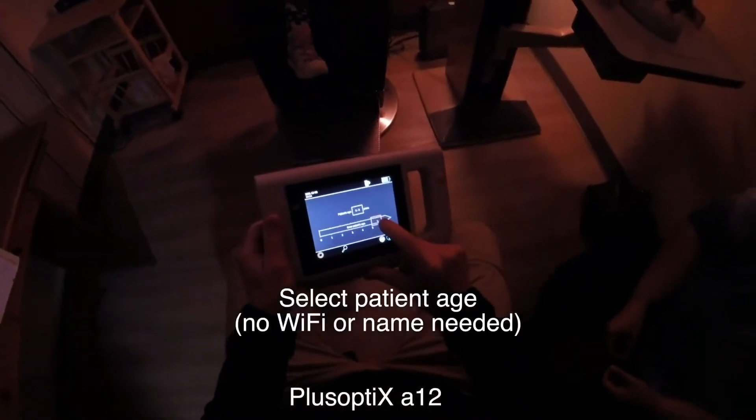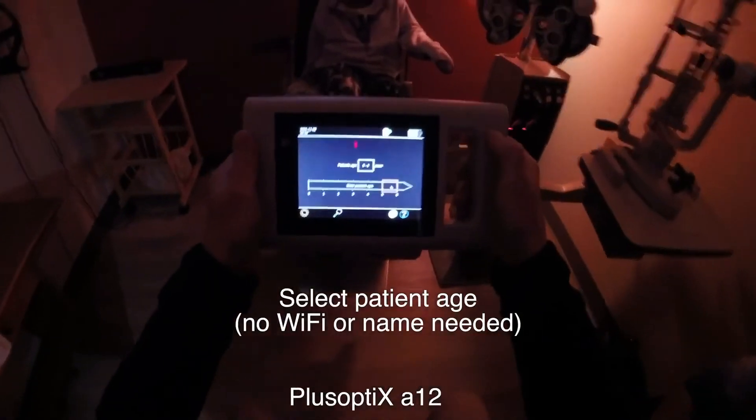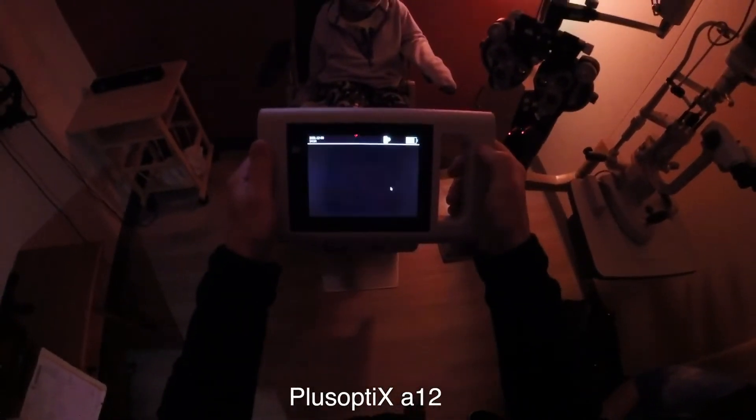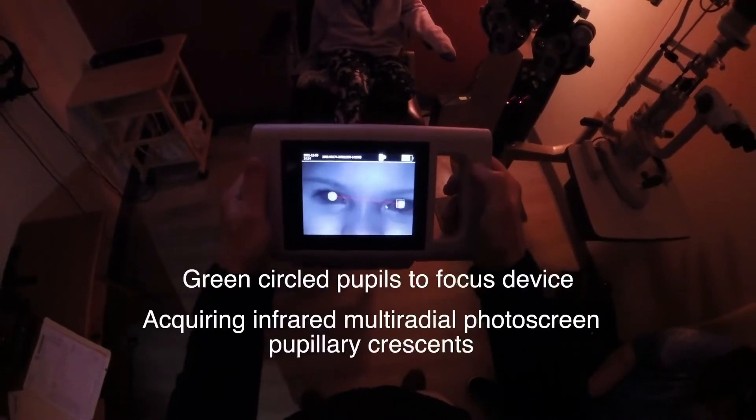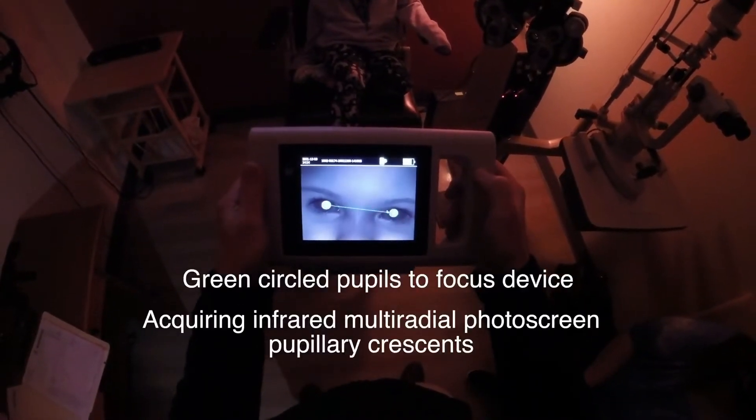Like when Dr. Tulip does it, he checks number five — like a five-year-old. Now let's take a little look just like this. You're doing great; we'll move it back so the green is just right.